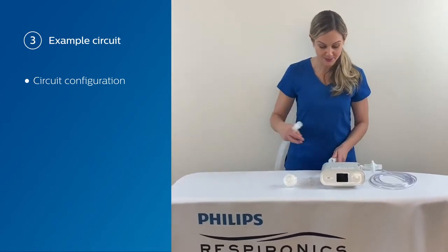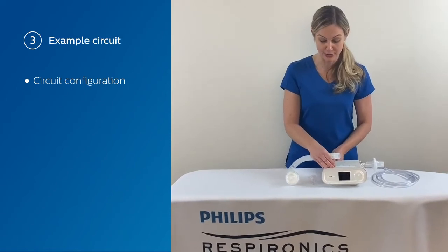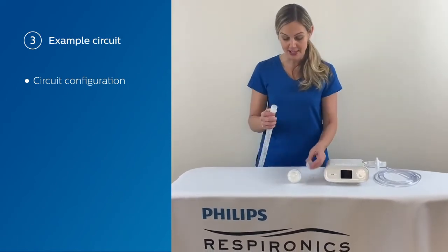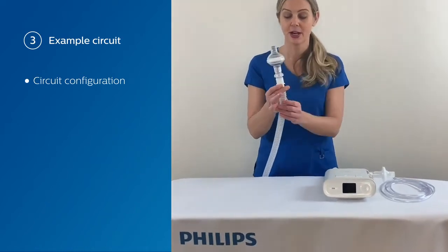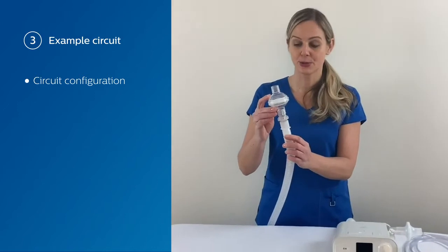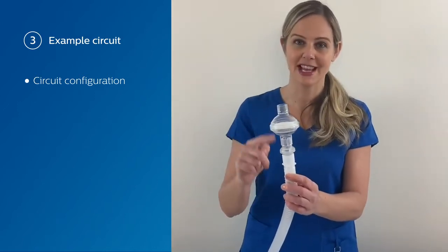What you do is take the tubing and connect it to the outlet port. Now, you're going to connect your exhalation device and your filter. Placing this filter here is going to work for both the inhalation and the exhalation.